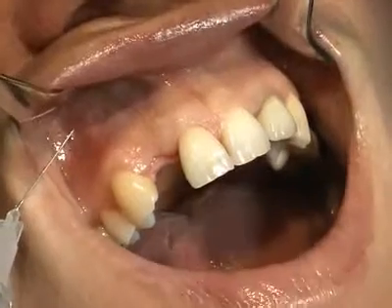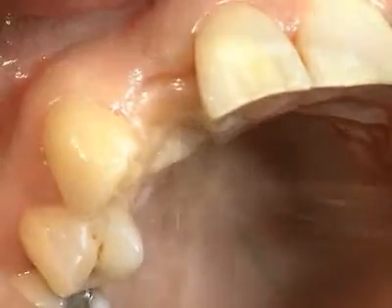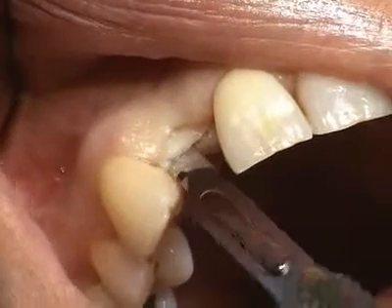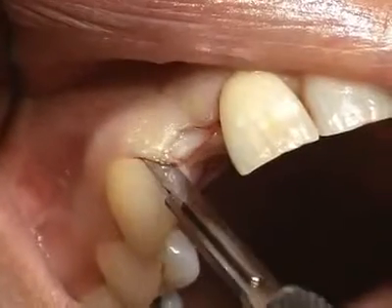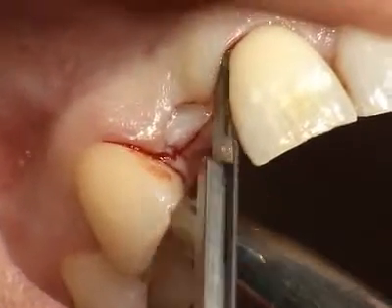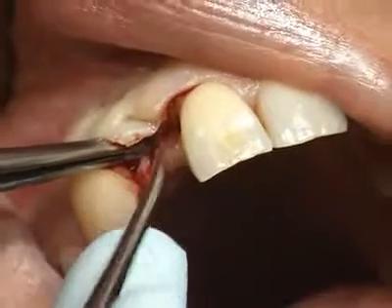For the procedure, terminal anesthesia of the vestibular and palatal mucosa is administered as usual. Exposure of the alveolar process commences with an incision on the ridge, which is made slightly towards the palatal side. The incision is continued carefully in the vestibular direction in the sulcus of the adjacent teeth. The mucoperiosteal flap is raised with a fine periosteal elevator.